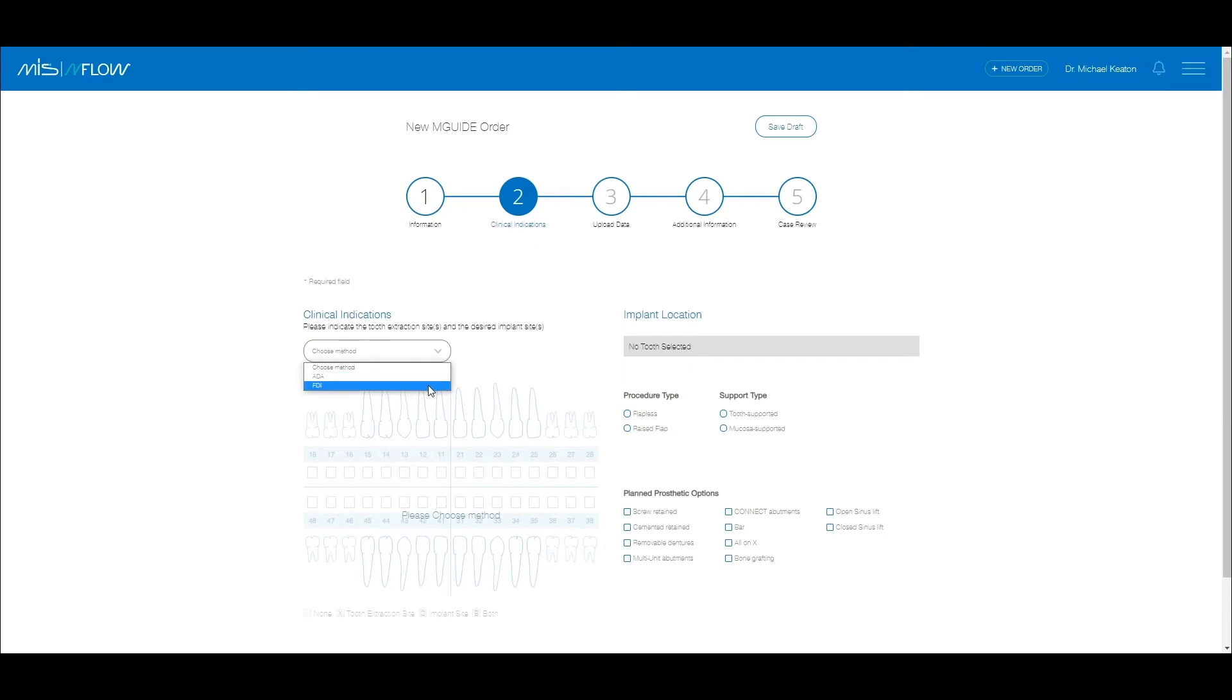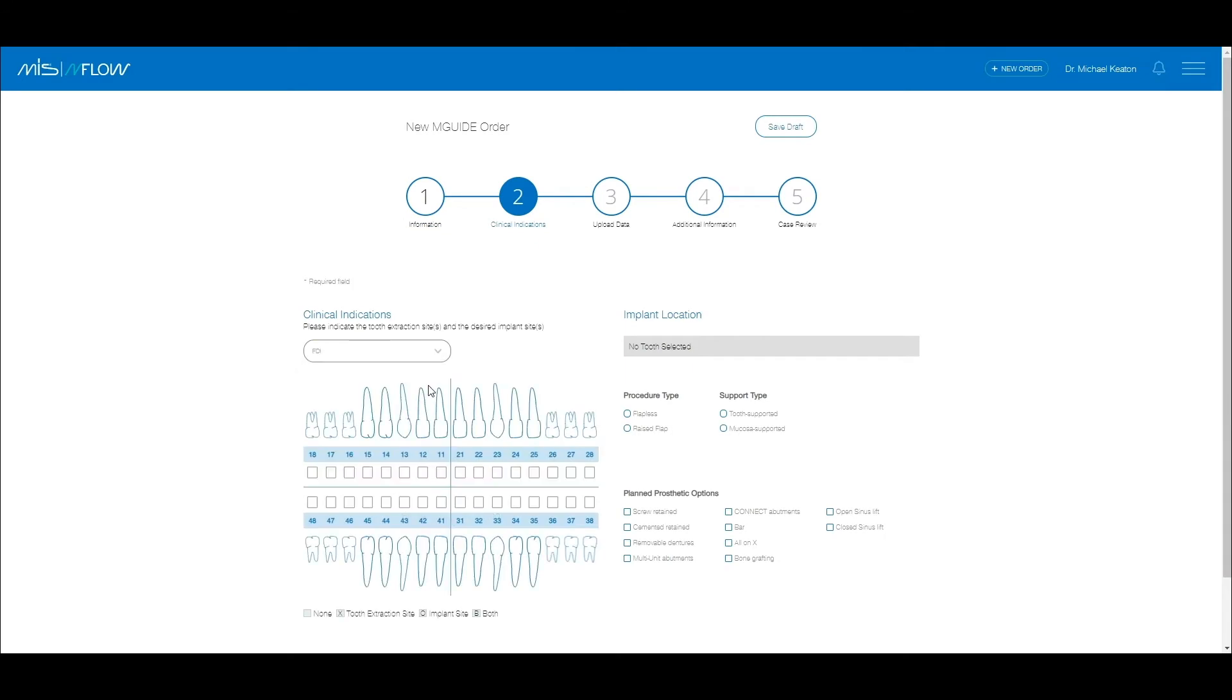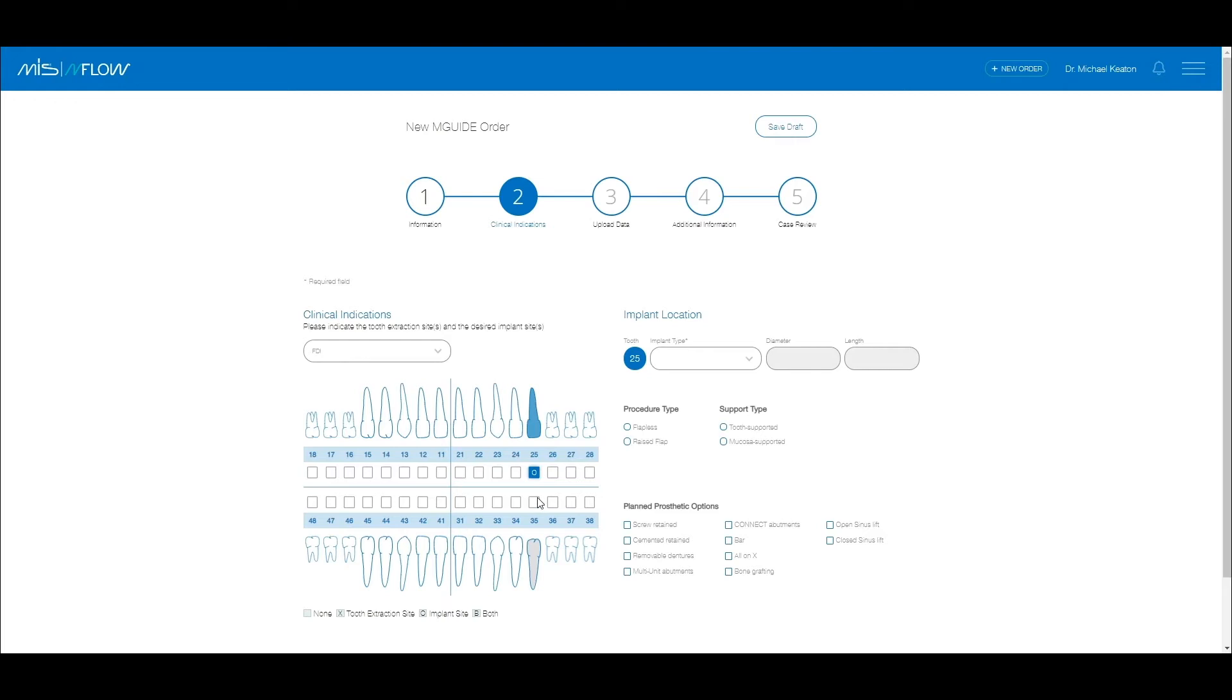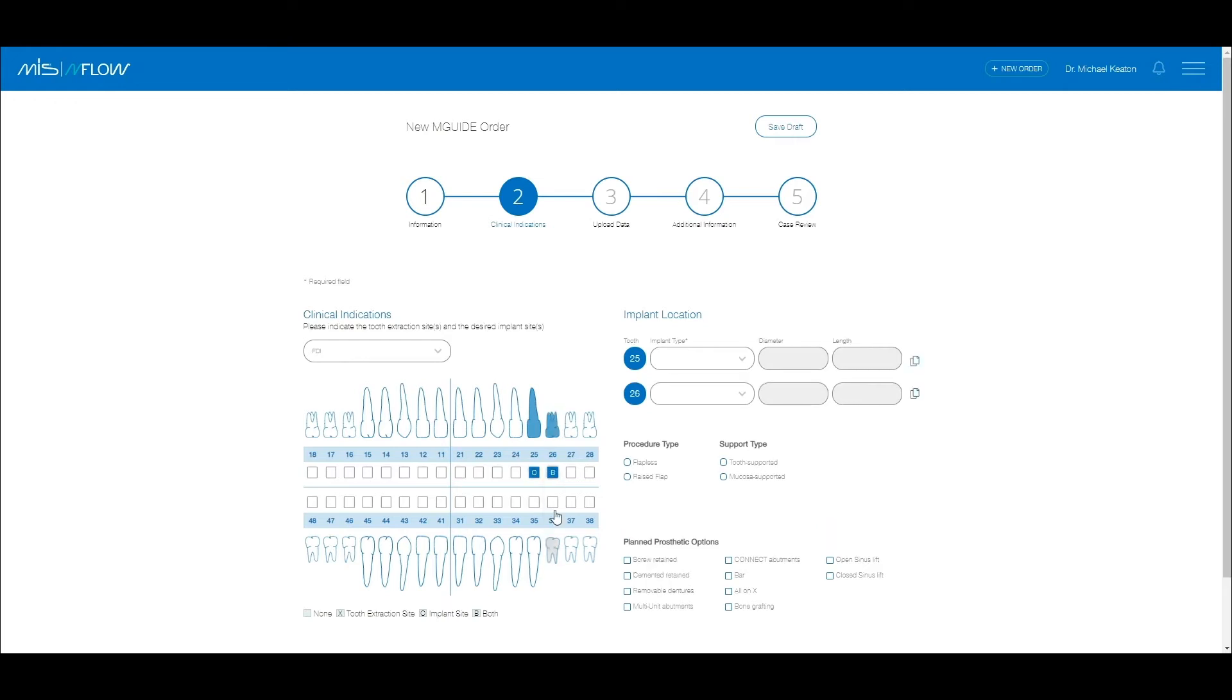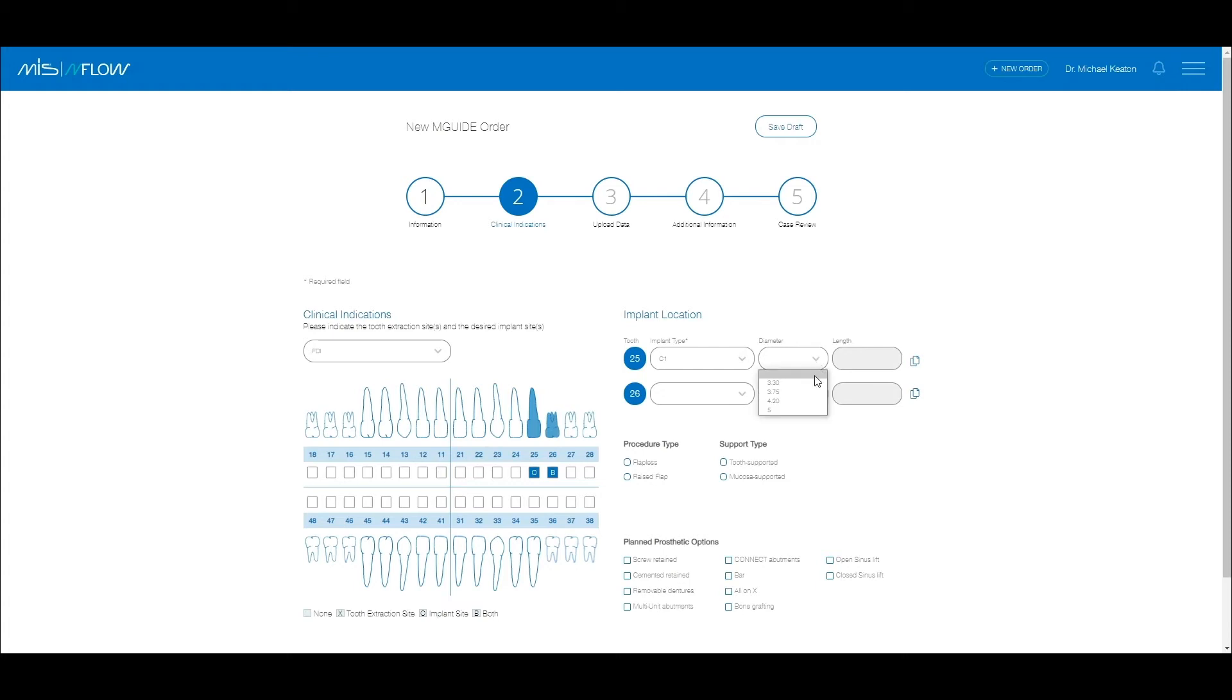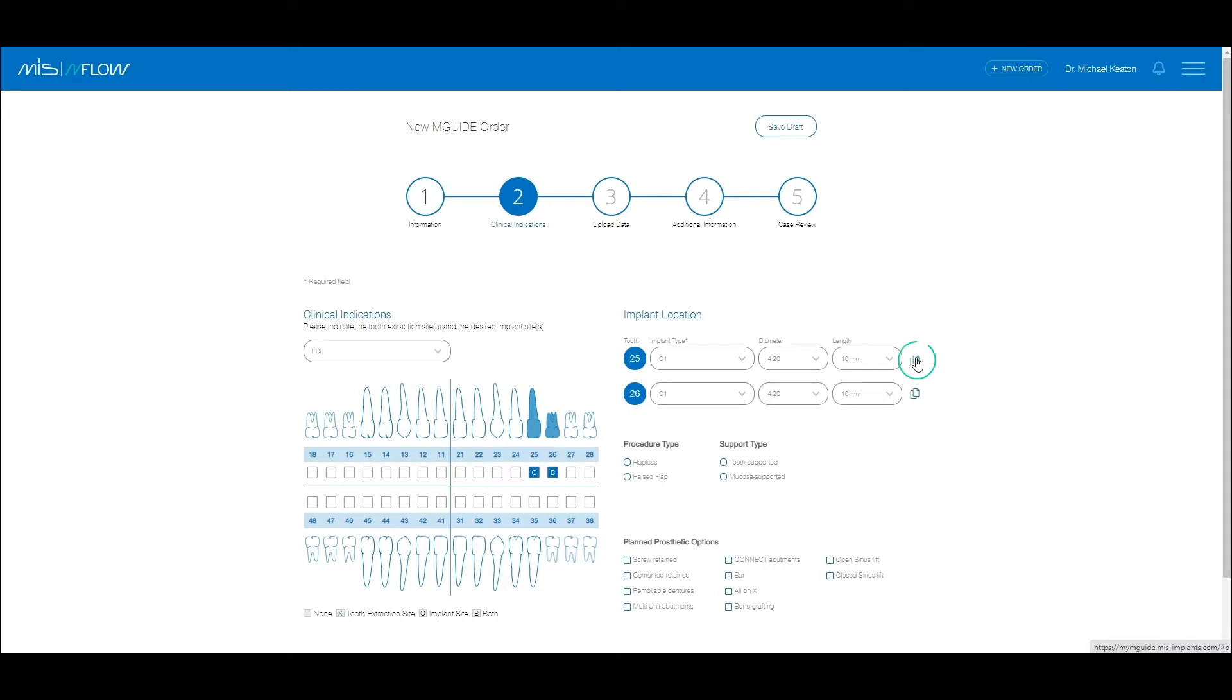Choose the numbering method and continue to complete the treatment sites and types info. For each implantation site you choose, a new row will be added in which you will choose the implant type. Diameter and length are optional at this stage. You may also choose the copy icon to copy the implant details to the next row.